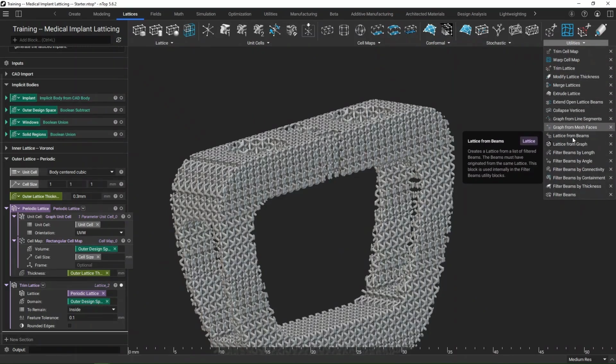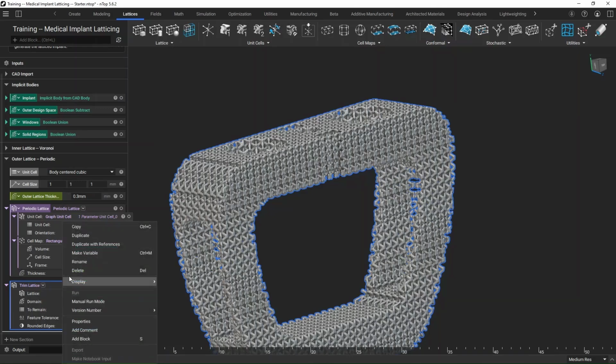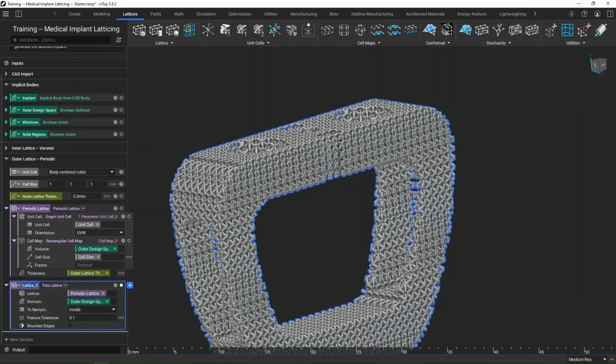If I look at the utilities, I have a lot of different filter blocks. So we can filter out open beams, or if they're not connected or floating, things like that. So a lot that we can do. This looks fine for me right now, but perhaps in the future, we've got different ways that we want to manipulate this lattice, have a little bit more control. But for now, I'll go ahead, make this a variable, and we can call this our outer lattice.